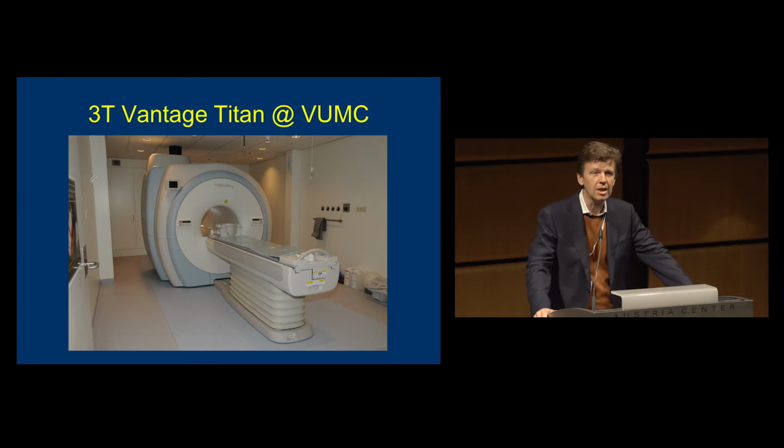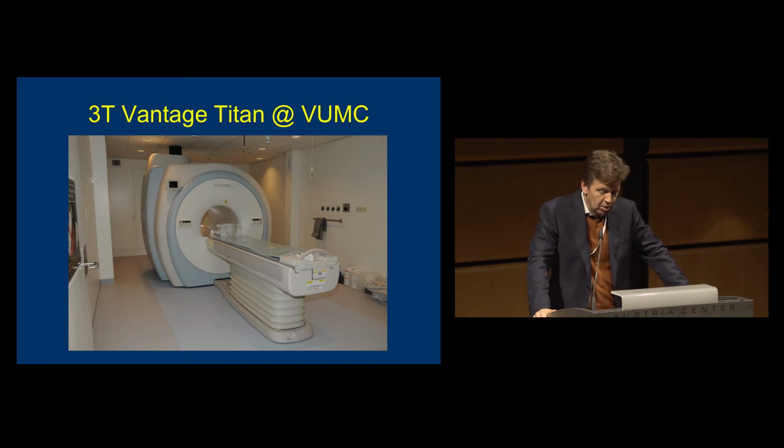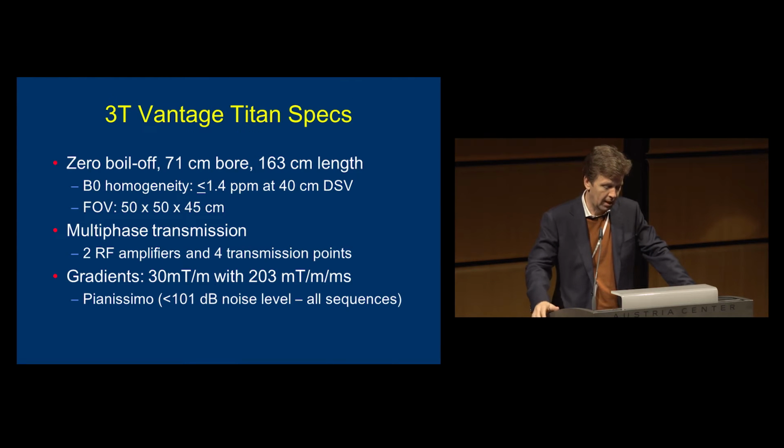This is actually the site hosting in our hospital. We put it in a room where previously a 1.5 Tesla was, so it easily fitted in there, so it doesn't have huge space requirements.